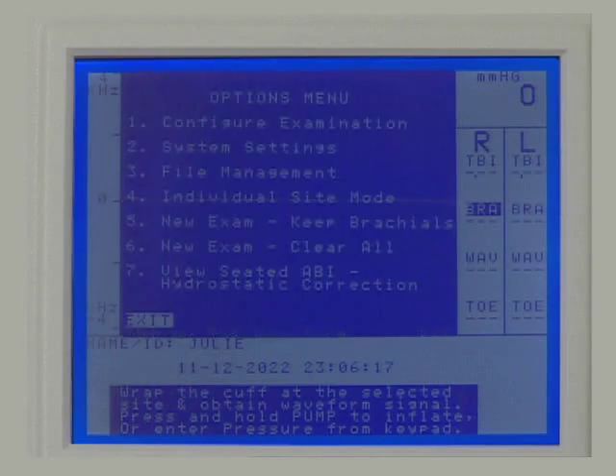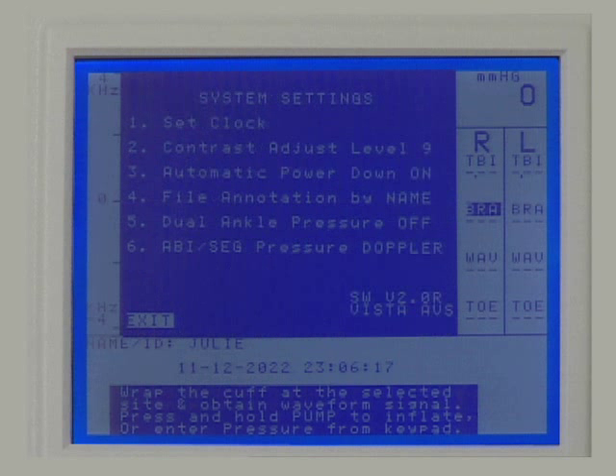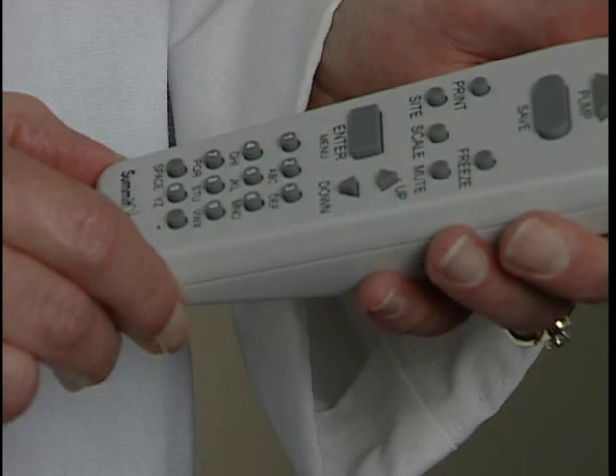To begin, press Enter/Menu to open the options menu. Press 2 for system settings. Unless you plan to use pressures from both the dorsalis pedis and the posterior tibia for determining the ABI, make sure that dual ankle pressure is off by pressing 5 until the setting is off.